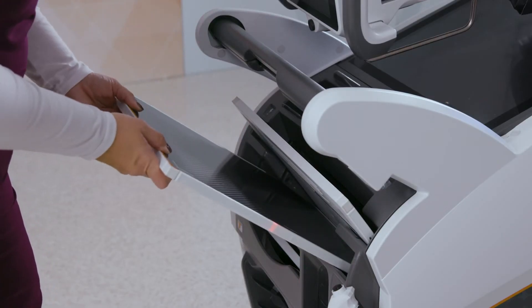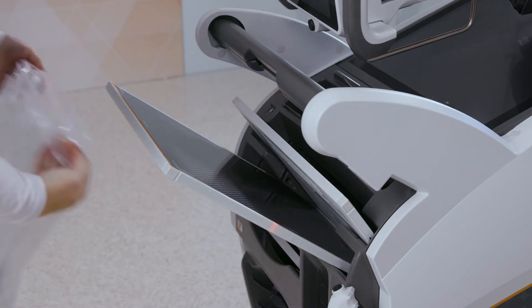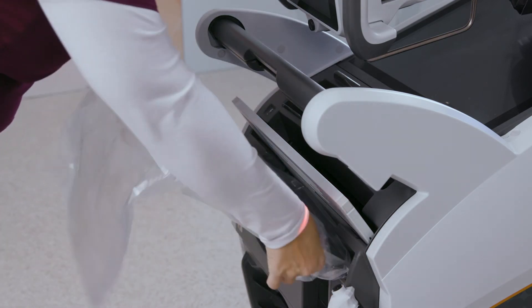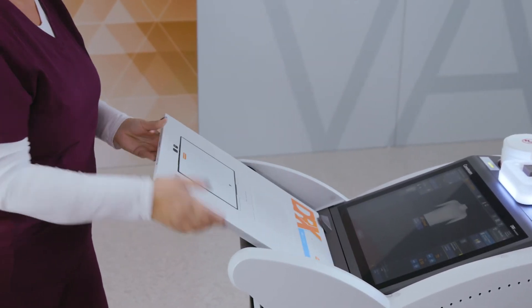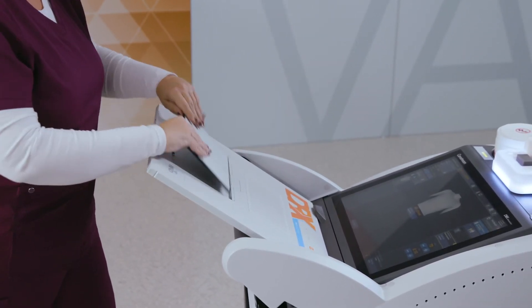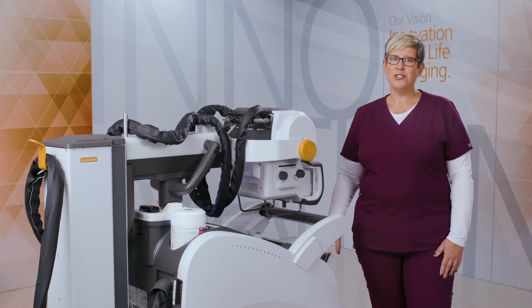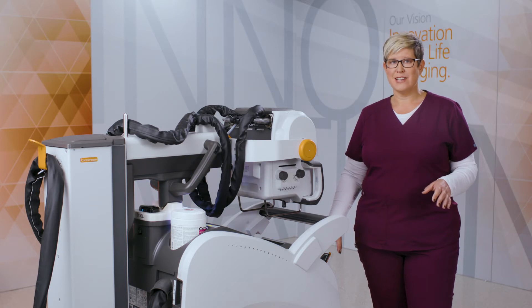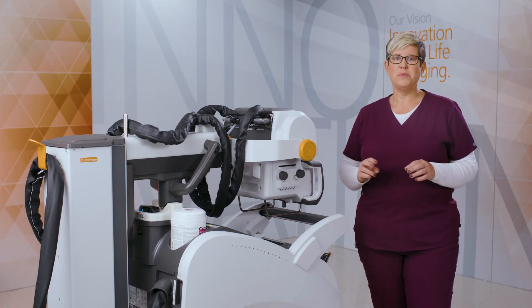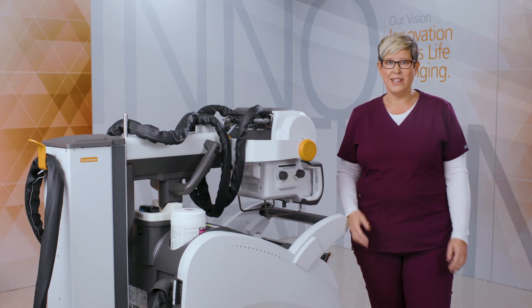There are built-in shelves in the storage bin which gives the technologist a second set of hands to bag and unbag the detector. There's also an area on the top of the display monitor which safely holds the detector while changing the battery. The top slot in the detector bin offers detector charging for either a 3543 or 4343 detector, along with storage slots for up to two spare batteries. This means less concern of not having a detector when needed.